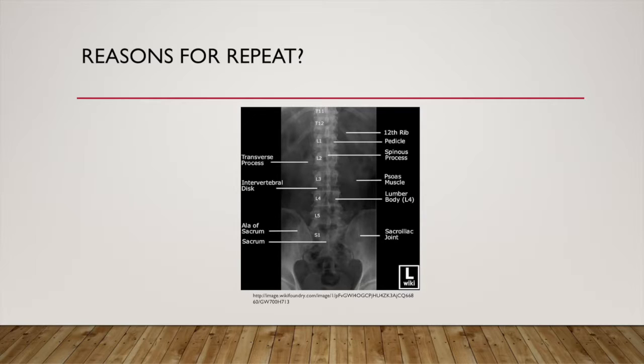But if it's still captured what the radiologist originally wanted to see, then you can save the patient from another exposure by calling the radiologist first and making sure if any more images are even necessary. Also, it could be that there was some motion due to the patient breathing heavily or artifacts such as zippers or coins in the pants pocket that got in the way. So you want to make sure that there's no artifacts and give the patient clear breathing instructions.